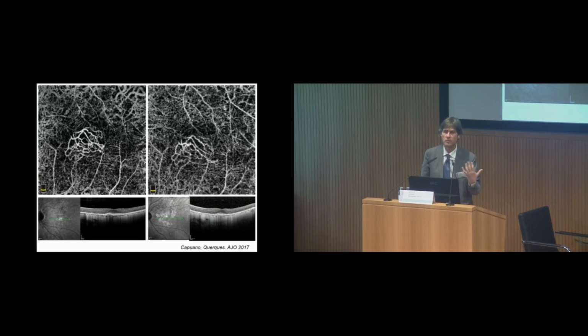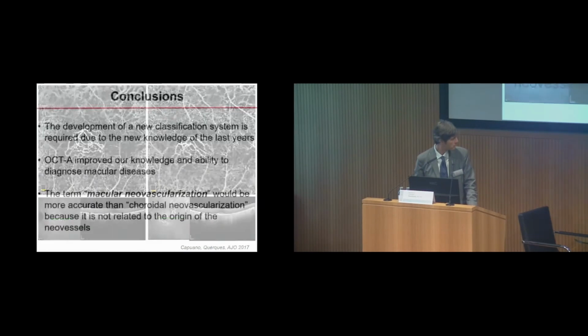And this is something really important because it seems to be extremely important to preserve the fovea, a kind of nourishment from the type 1 for the outer retina that may prevent progression. We should not treat these cases, and it was also demonstrated recently. A paper was presented at the American Academy. There's no benefit in treating fellow eyes of neovascular AMD or in treating quiescent type 1 neovascularization.